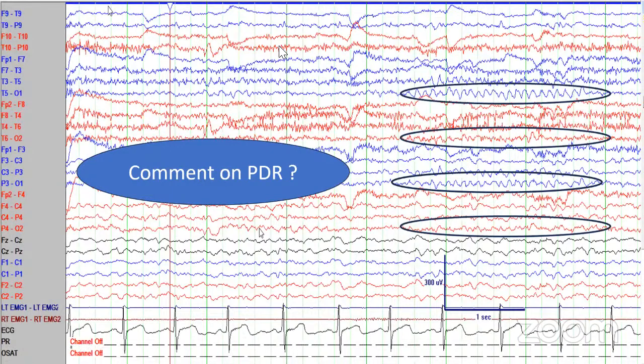So we have this fast activity happening here over the temporal region. This is usually found if the person is tensing his or her muscle on that side. So this is one artifact. Plus we also have these eye blink artifacts, and we have some subtle amount of lateral eye movement, which will be better appreciable on the subsequent slides.